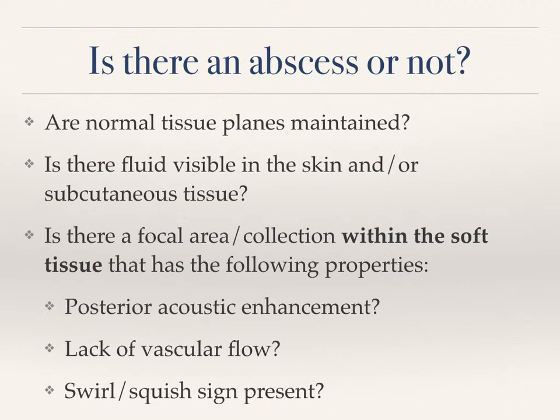So that is it in a nutshell about assessing skin and soft tissue, assessing for fluid within the tissue to fit that into our clinical picture to determine if we think this is a cellulitis, and then also to assess if there's an abscess or not that we think needs incision and drainage. Again, do we have normal tissue planes? Is there fluid visible in the skin and subcutaneous tissue? Knowing that those two questions are really answering the question about a cellulitis or not.